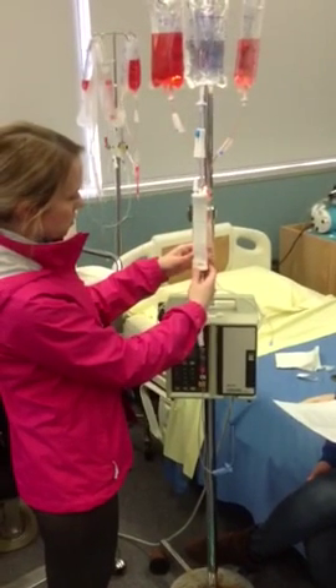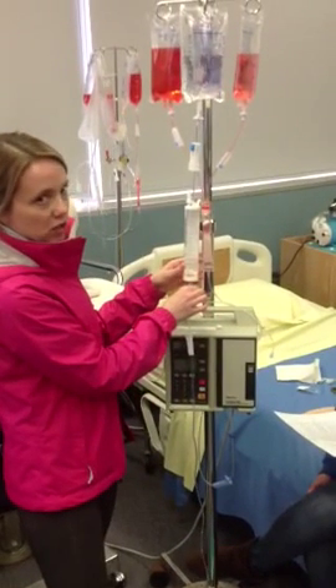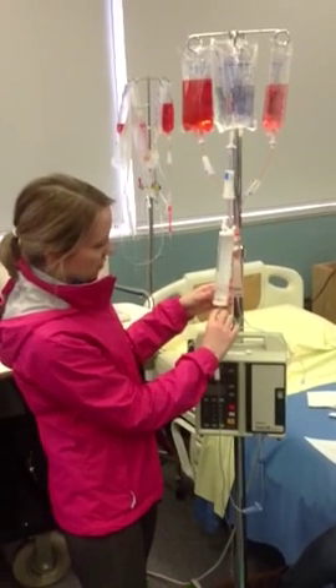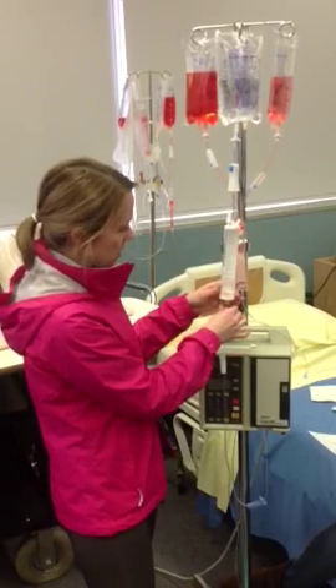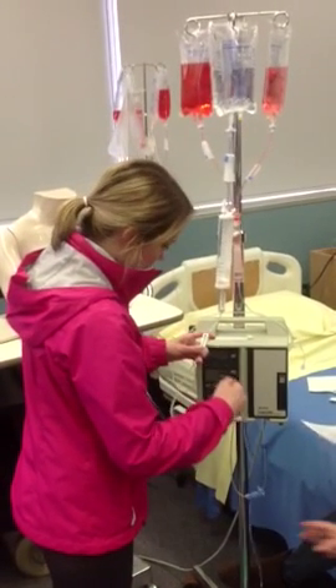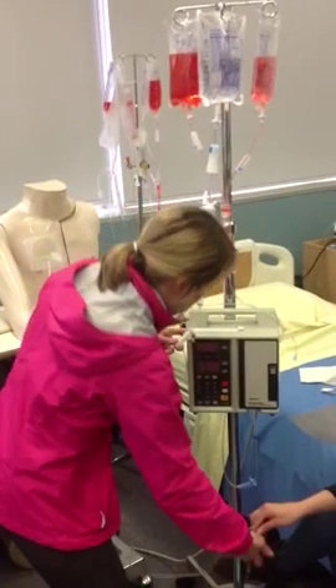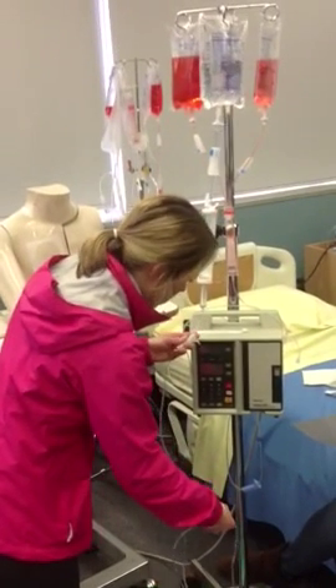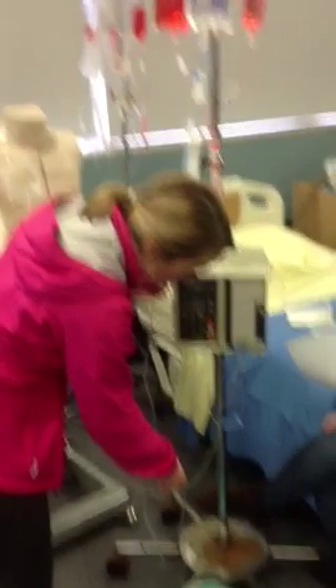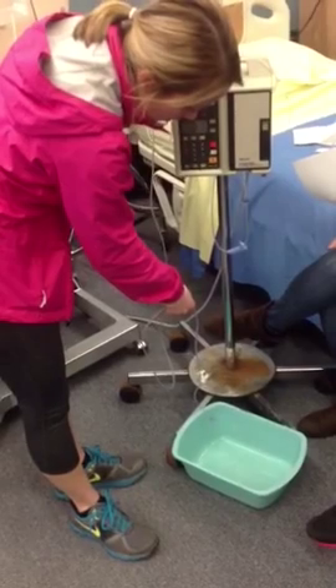We'll clamp it back off once there's 30 milliliters. Then we're going to fill the drip chamber about two-thirds of the way. Then we're going to want to prime the line, so we'll go ahead and open up this bottom clamp.